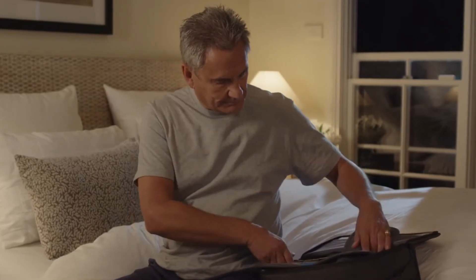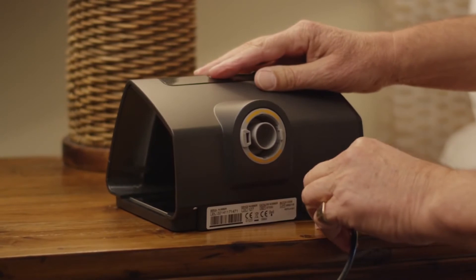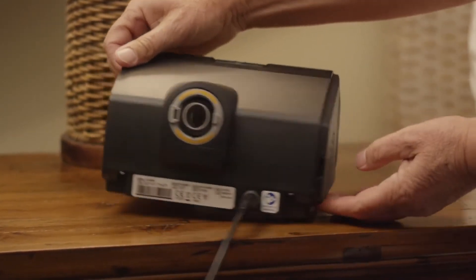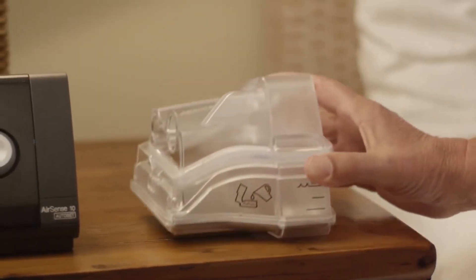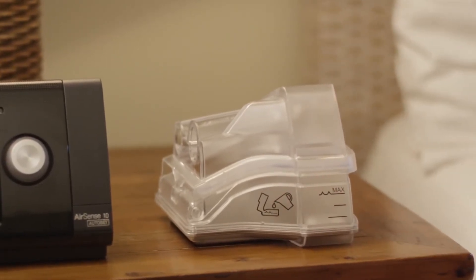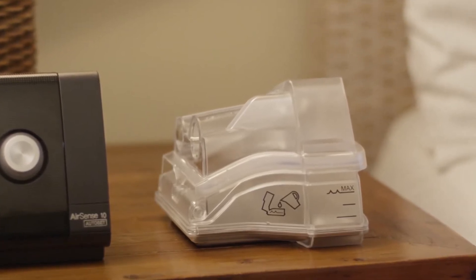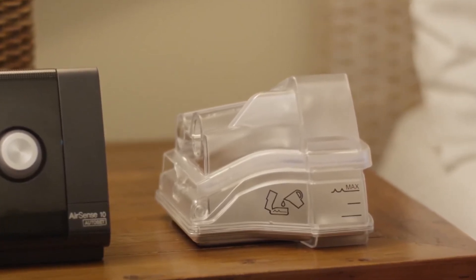First, take the device out of its bag. Connect the power supply and plug it in. The HumidAir Heated Humidifier is built into all AirSense 10 and AirCurve 10 therapy devices, so you can now enjoy the benefits of humidification in one easy-to-use system.